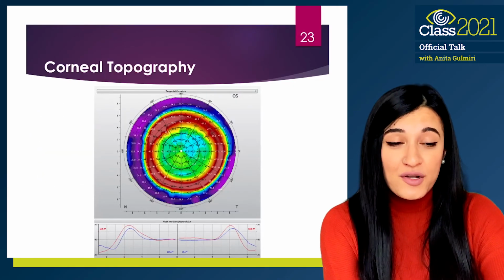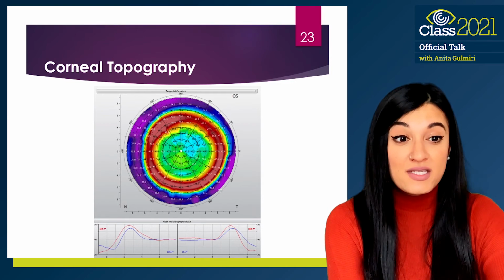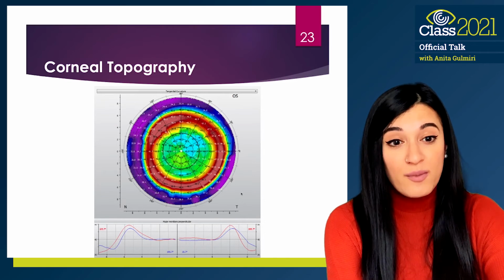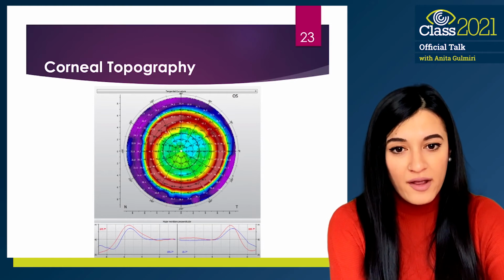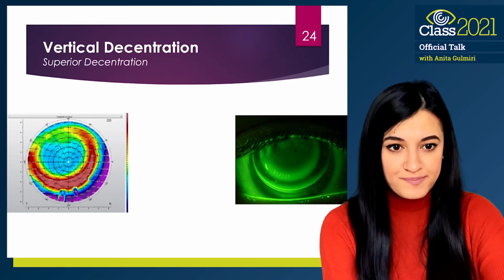So the ideal corneal topography pattern will resemble a classic bullseye pattern, and it will be well-centered with a large enough treatment size to allow for comfortable vision for the patients. You can see here a symmetrical treatment ring or reverse curve zone that should also be well-centered, followed by an area of alignment curve that is flatter than that reverse curve.